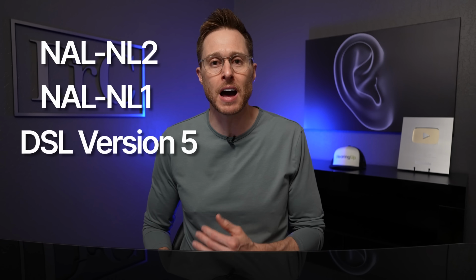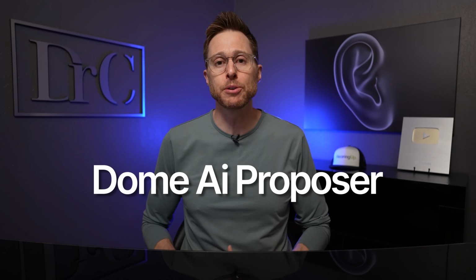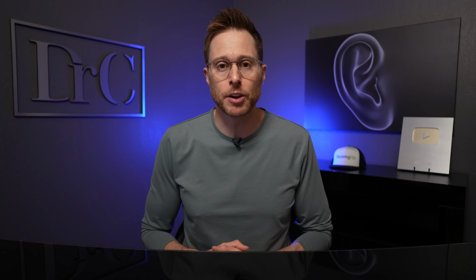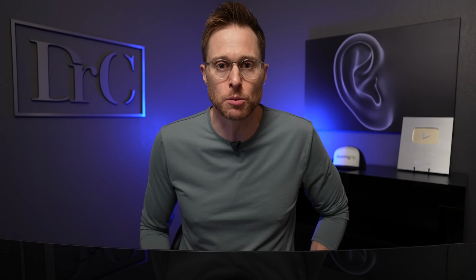There is a new feature called Dome AI Proposer that will help your hearing care professional select the appropriate dome for your level of hearing loss, whether that's an open dome, a vented dome, or a closed dome. And they do not yet have a custom ear mold AI Proposer, which would arguably be even better because I think that Phonak hearing aids perform substantially better in most cases when you use one of their custom ear molds.